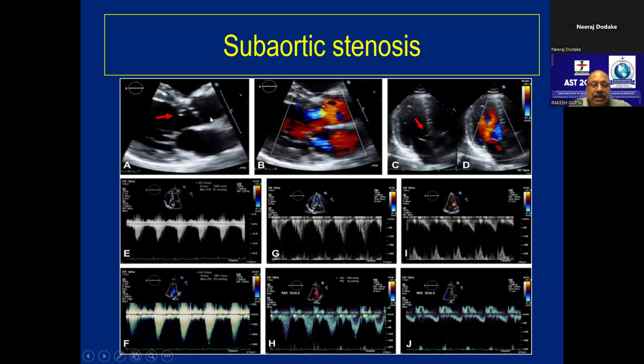Here is the membrane, here is hypertrophic cardiomyopathy. When this valve is sucked into the LVOT, the mitral valve remains open, so you get an MR, and here you get significant turbulence at the LVOT. In subaortic stenosis, you will get turbulence in the LVOT, but there will not be any significant MR, because here the membrane is acting like an obstruction. Here the leaflet is acting like an obstruction.